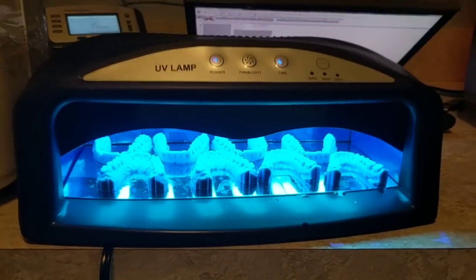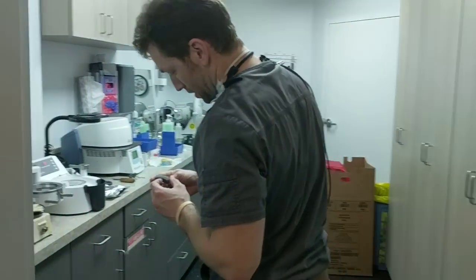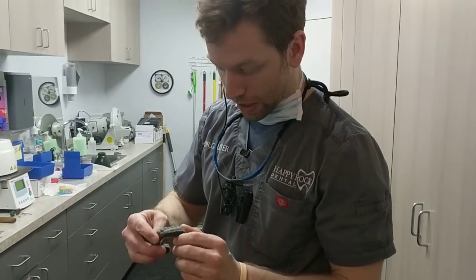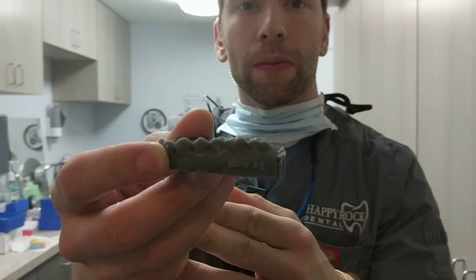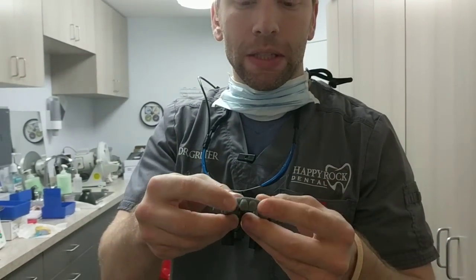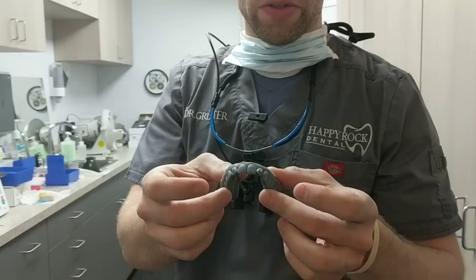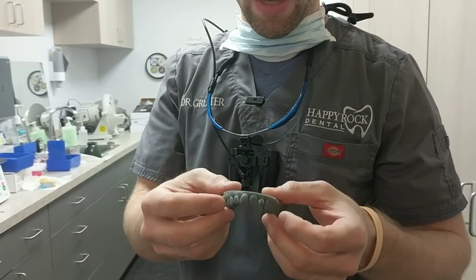I'm going to go ahead and grab this one and come out here where we have a little better light. You can see, a little dusty, but you can see that it says step one right there on the side. So this is actually going to be our tray that has buttons on it. We're going to use this to make the buttons, or attachments, whatever you want to call them, on the patient.